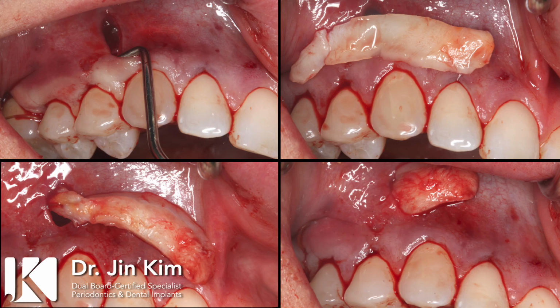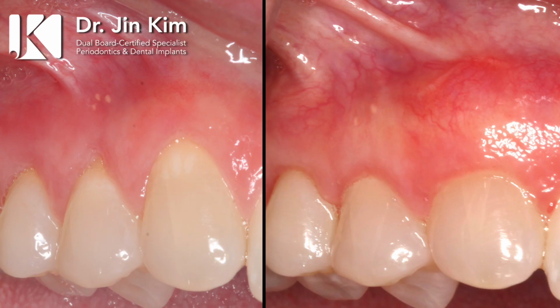So here is the clinical view of the steps involved. A small hole is created that is perfected into a tunnel where the tissue is carefully separated and advanced, and the graft is then tucked into the area, and sophisticated sutures are used to close things up. We always use a platelet-rich fibrin, which is the patient's own platelets that we derive from venous blood from the patient's own arm, and these cells bring growth factors to the area, expediting the healing.